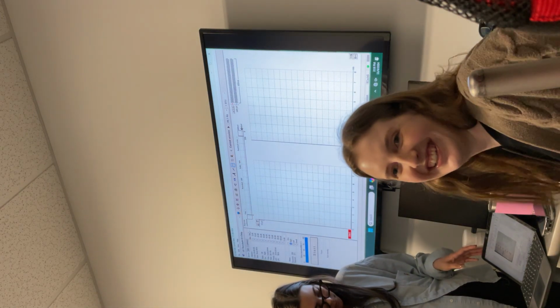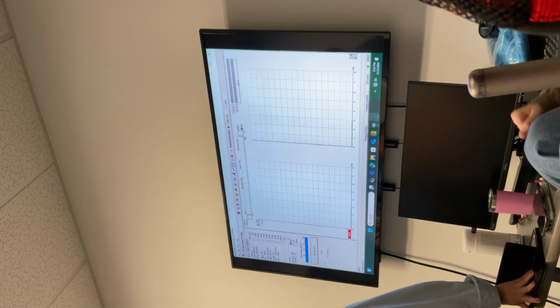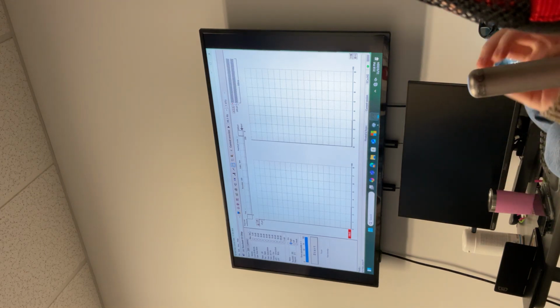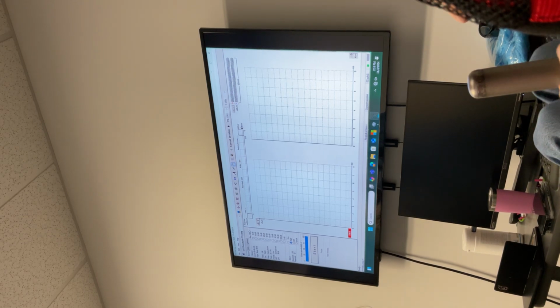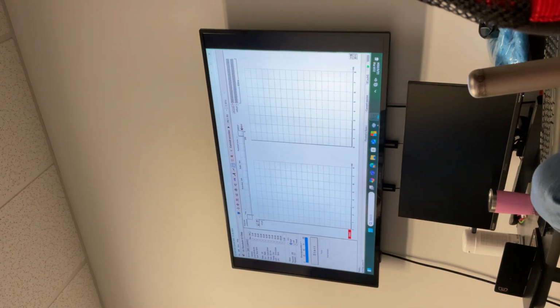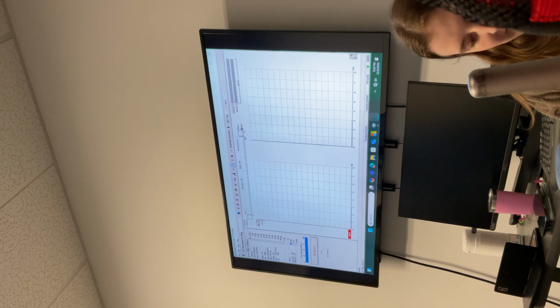I had a troubleshooting session with Eclipse, and they also recommended this same electrode. But the other one, the Sanibel, so many people have complained. When we asked for a return, they told us they already know of this problem. They sent new supplies, and even those had the same problem. Just give our money back. Are you switching manufacturers then? Not the electrode.